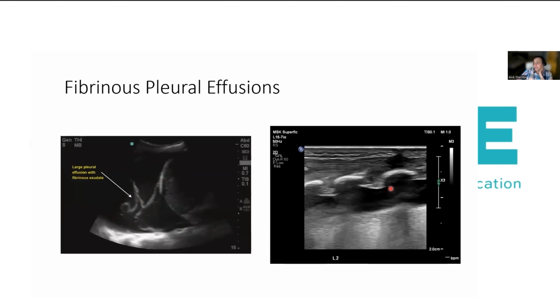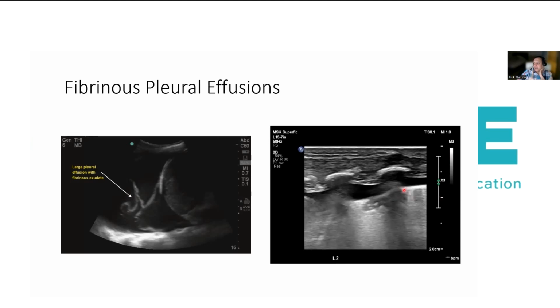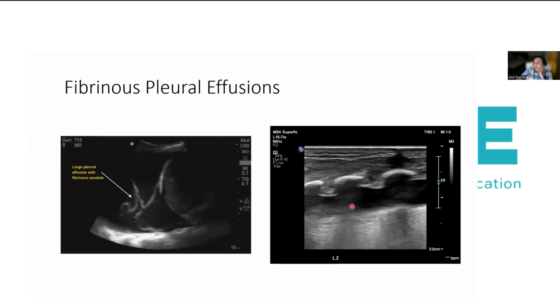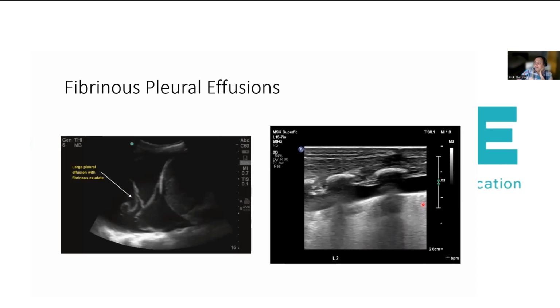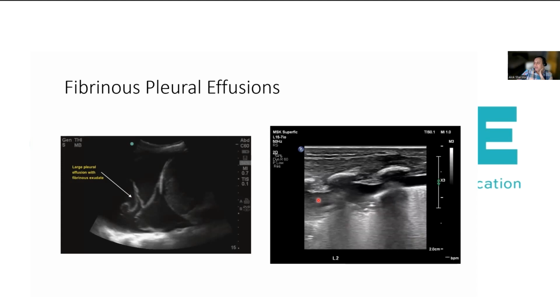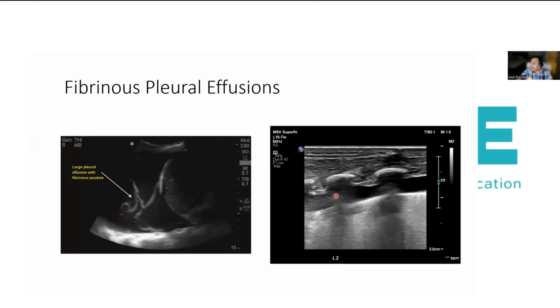And this is a baby who's basically had very thick, dense chyle. It's an antenatally diagnosed chylothorax. And what you can see, again, is the ribs, the intercostal space. You can see a classical curtain sign, the visceral pleura with the lung beneath that, which basically shows compressive atelectasis, some static air bronchograms. A classical, I would say, B profile is the way we would describe it. And you can see this density in between, this hyperechogenic material, which actually, when we tapped, we got a very chylous appearance to this. Baby was on feeds.